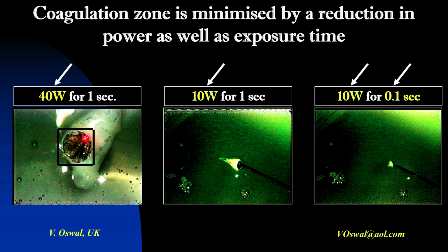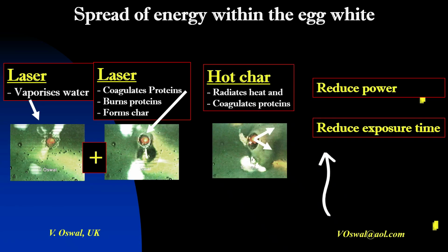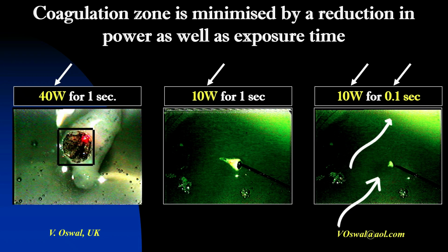Finally, I maintained power at 10 watts but shortened the exposure time to just 0.1 second. The third frame demonstrates significantly reduced deeper tissue spread. These findings highlight that exposure time plays a far more critical role than power in minimizing the deeper spread, making it a key parameter in precision laser application.